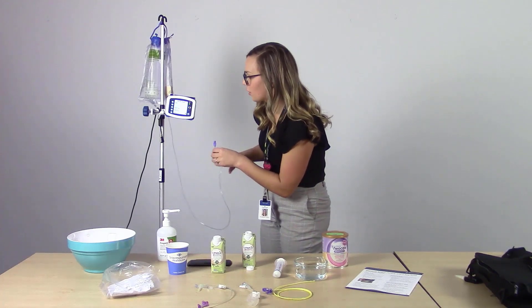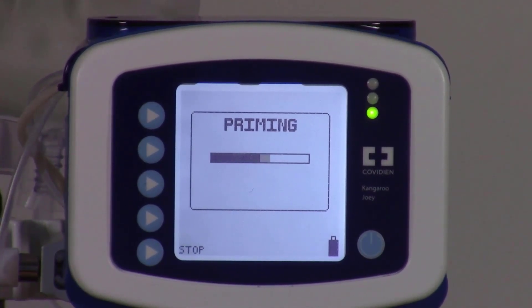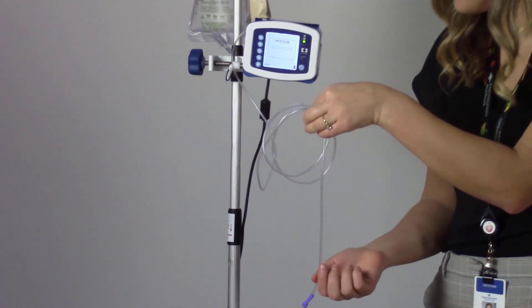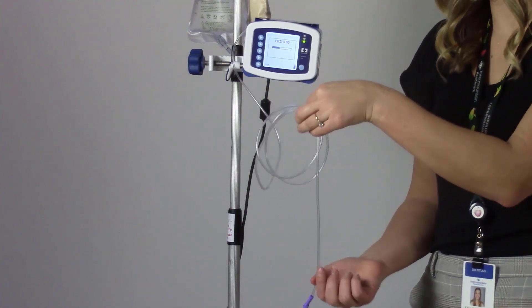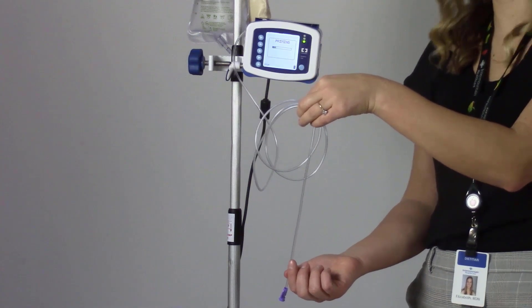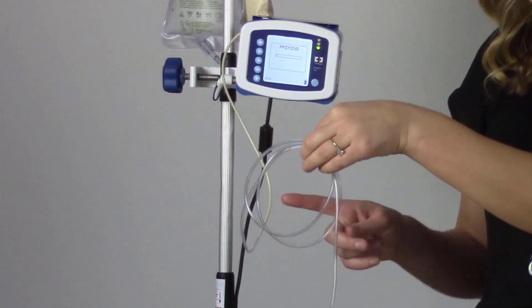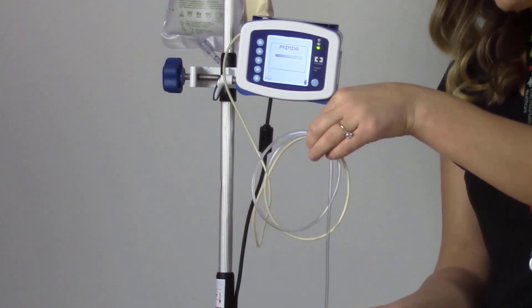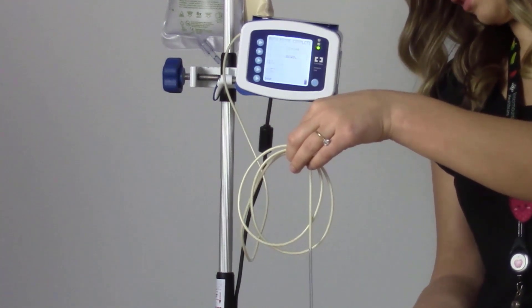We are going to select auto prime. On the screen, it indicates priming, and we can hear the rotor spinning around. The formula is starting to fill the tubing. We can notice that there's a little bit of water starting to fill first and then followed by formula. The water first leaves the tubing, and then the formula follows.